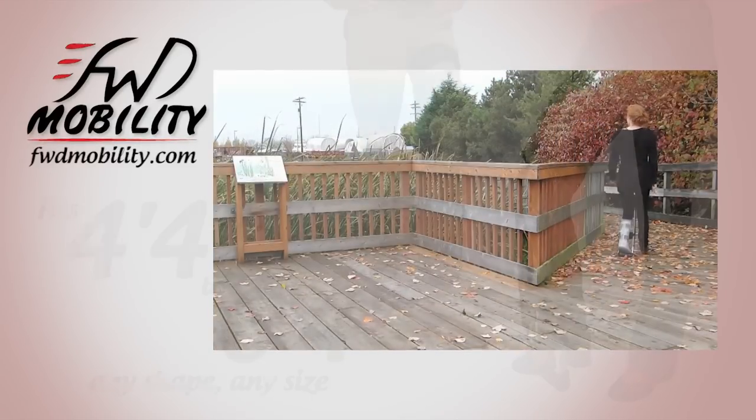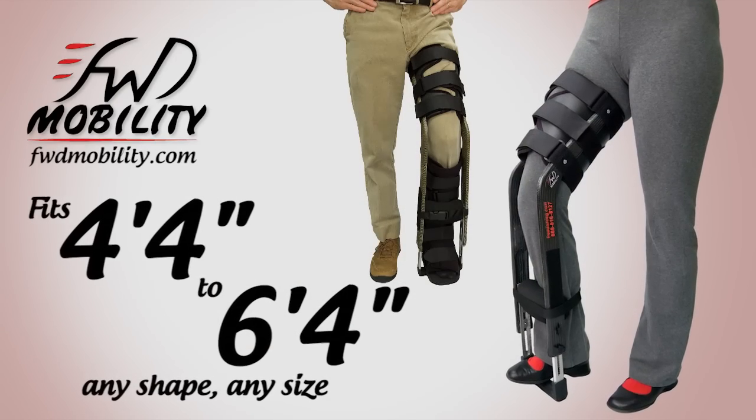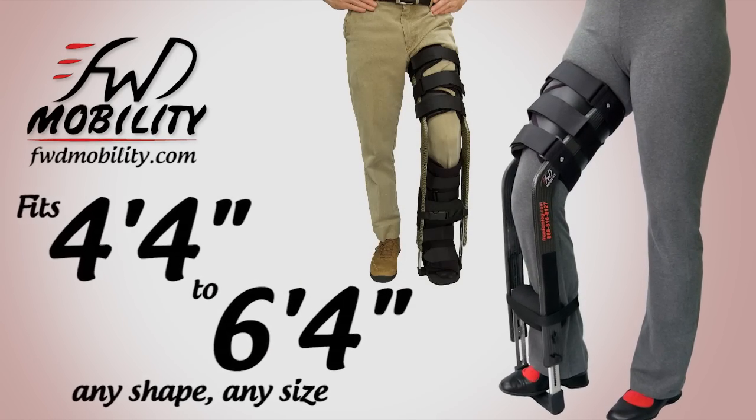The brace is designed to fit a full range of users from 4'4" to 6'4", any shape or size. One of the most rewarding aspects of developing the Freedom Leg is the response we've got from our customers. We get phone calls and emails every day thanking us for allowing them to continue their life during this rehab time.